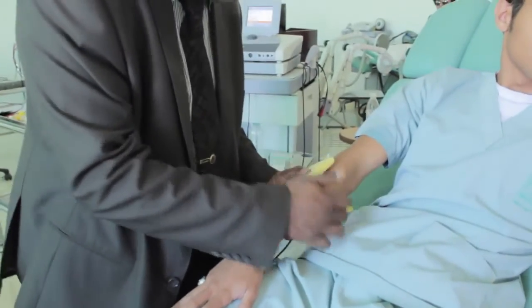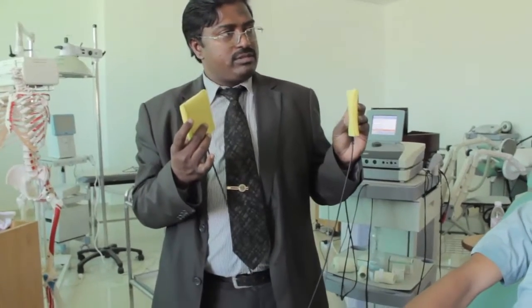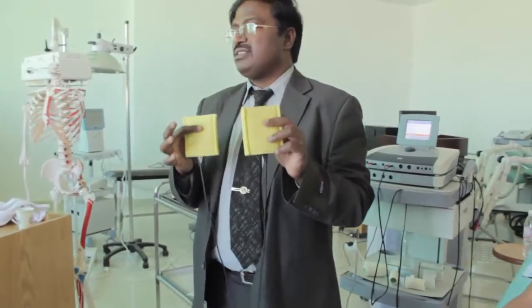Second, how much should be the distance between two electrodes? If you keep like this, how much should be the distance between these electrodes? Depends on the patient. The usual rule is the width of the electrode. That much space should be there between two electrodes. If the electrode width is 5 centimeters, then the distance between this electrode and this electrode should be minimum 5 centimeters. It depends upon the width of the electrode.